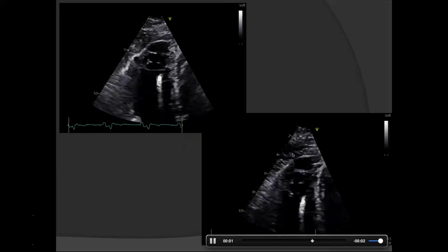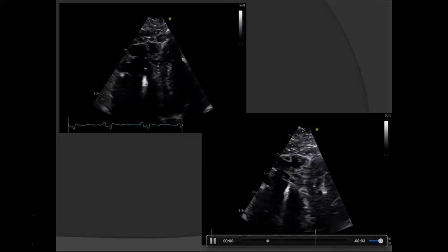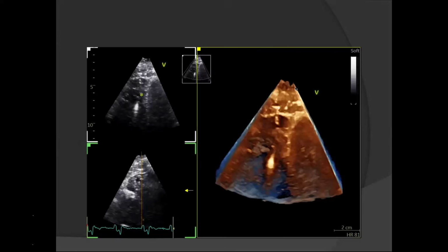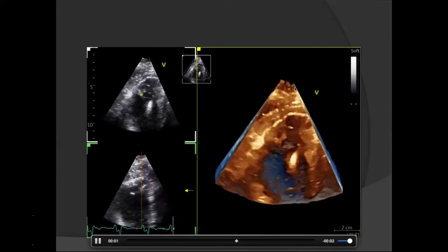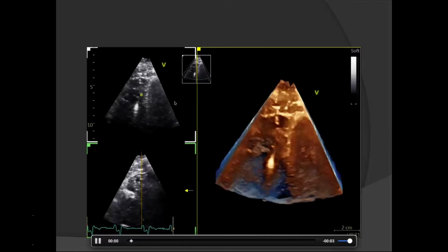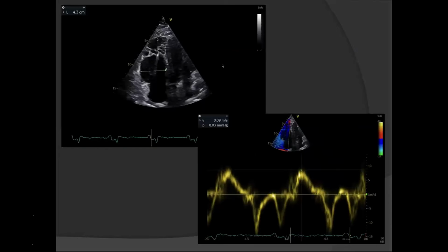This is a gross, clear example of a known case. But if you are suspecting ARVD, look at these views, zoom your images, and look out for ARVD microaneurysm. 3D echo also brought out this aneurysmal bulging very nicely. Orthogonal views also demonstrated the same abnormality very nicely.